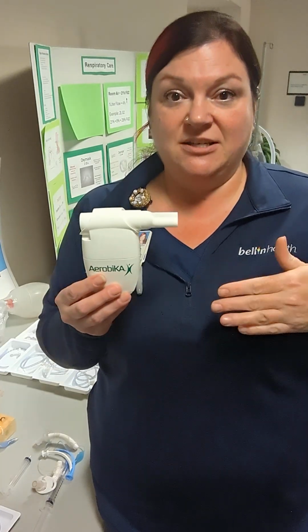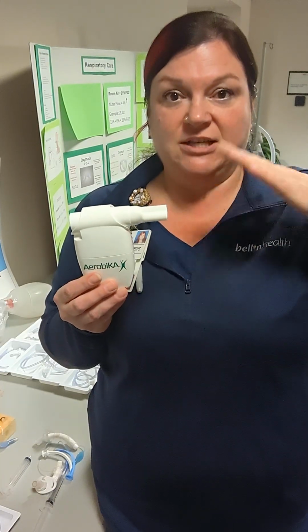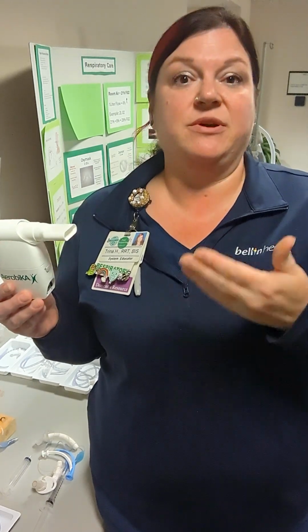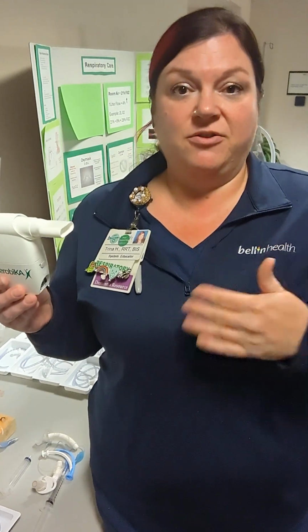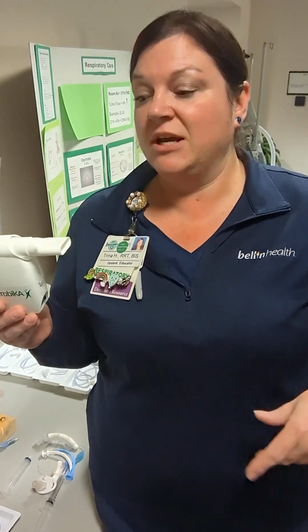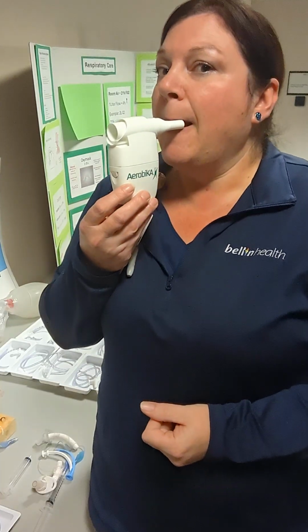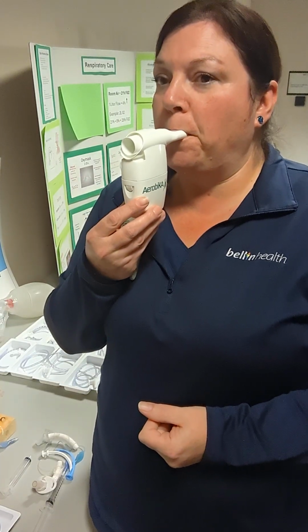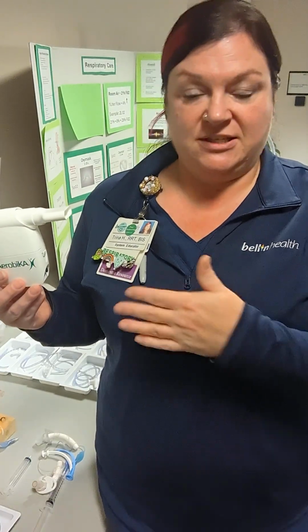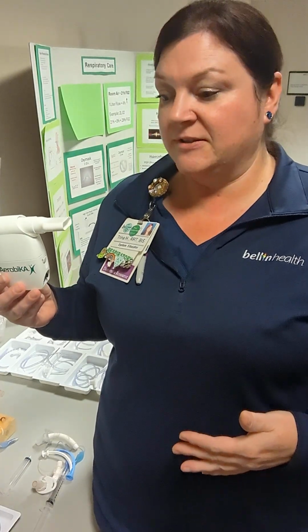So when a patient exhales forcefully into it, it creates vibrations. Those vibrations come back to the person, they reverberate, shake all the phlegm on the lungs in the hopes that when they cough, they can then expectorate, spit it out. So it sounds like this. And you can hear that chugga, chugga, chugga. Those are vibrations that are knocking around inside my lungs.